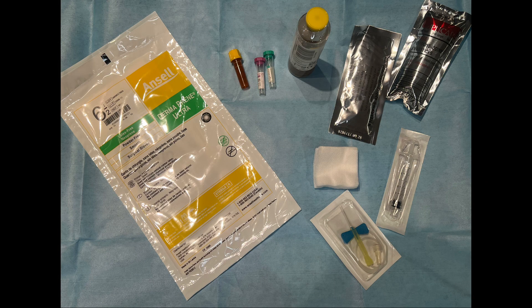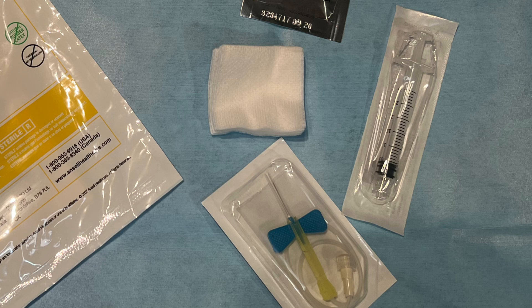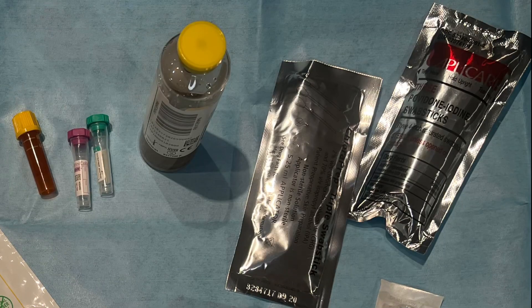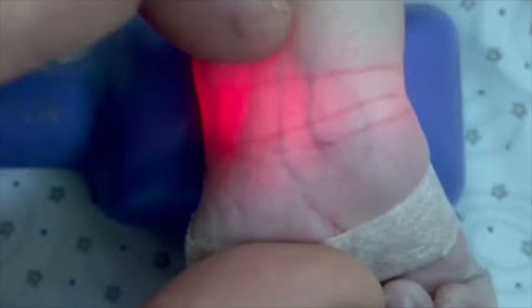Equipment and supplies often depend on the blood work needed. You will definitely need sterile gloves and a 23 to 25 gauge butterfly needle, as well as your appropriate syringes, your pre-heparinized blood gas syringe if needed, and your cleaning solution per unit protocol. You'll also need 2x2 gauze pads, and you can optionally use a high-intensity fiber optic light for transillumination.